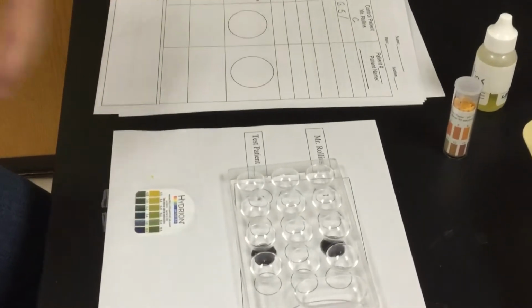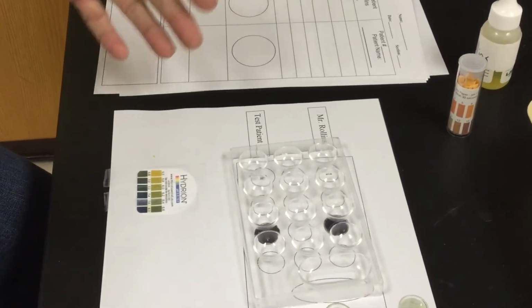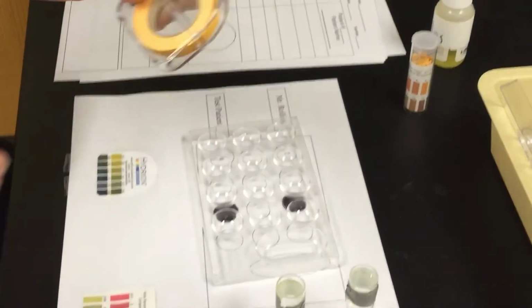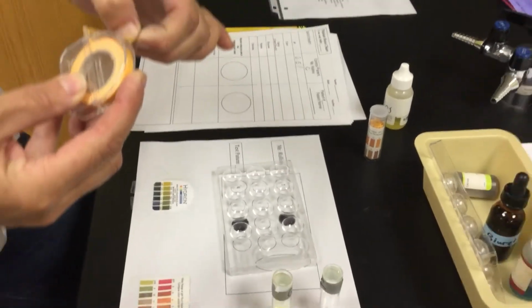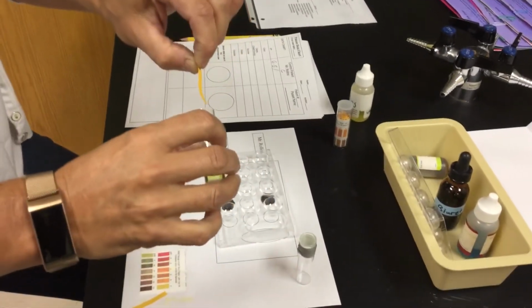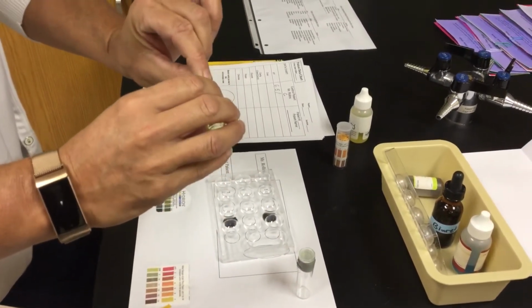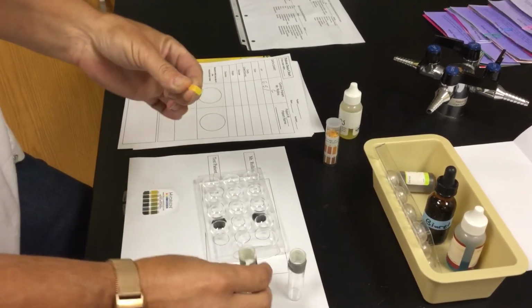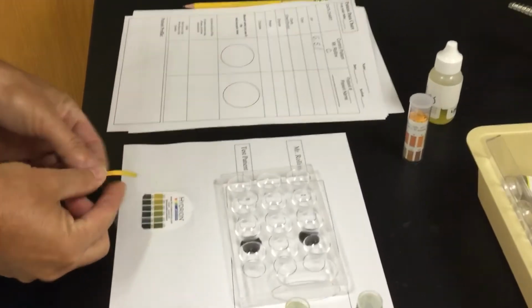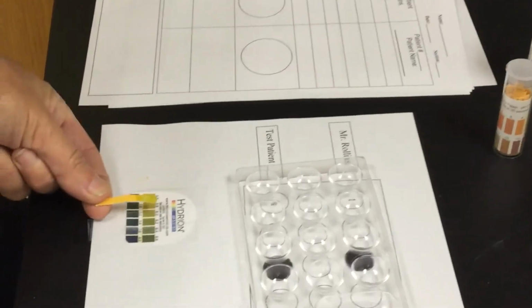So it's giving you every 0.3 or 0.2 numbers, and it's just going to be a little bit more specific. Looks just like the other one. This one's in a roll. You'll actually just take a little piece. You're going to go through, you're going to rip it off, and we're going to do the same thing. A couple drops. Hopefully we can get some on there. There we go. And now we're going to go through and match that up. And we want to match that color along here.